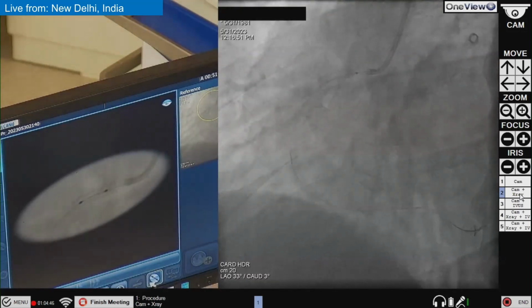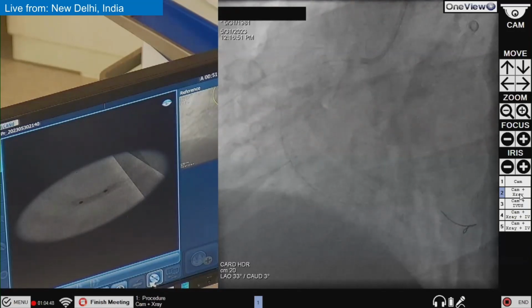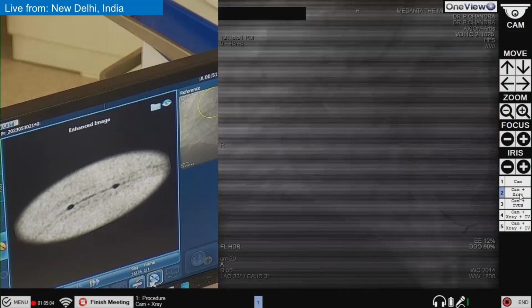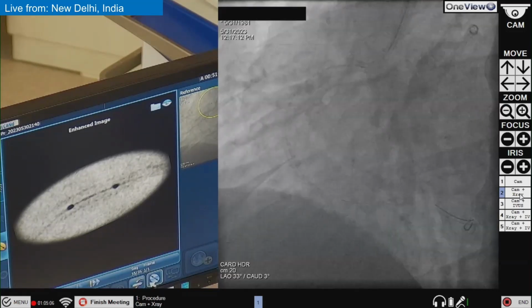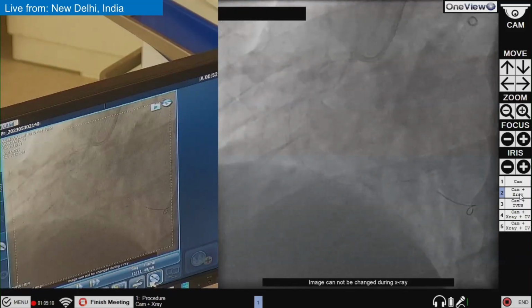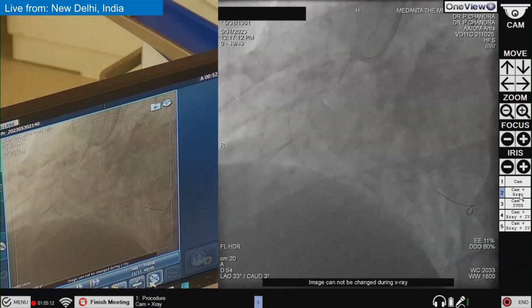You should always use this stent boost, which is now available in various ways. We have one in this cath lab itself, which is the Siemens. And this is the Volcano, which is known as the co-registration system. We can even do a co-registration, but for that we need to do injections. So we need to do that.